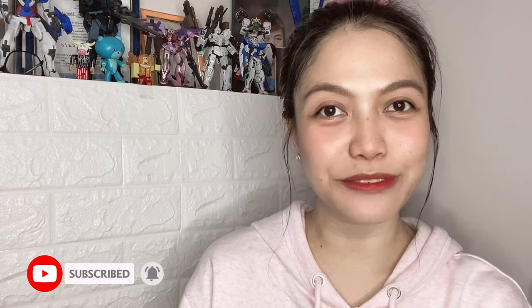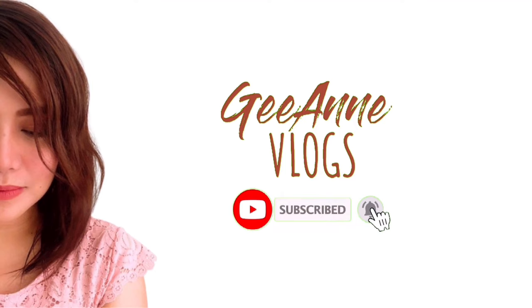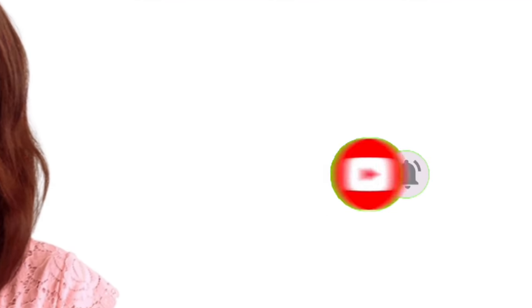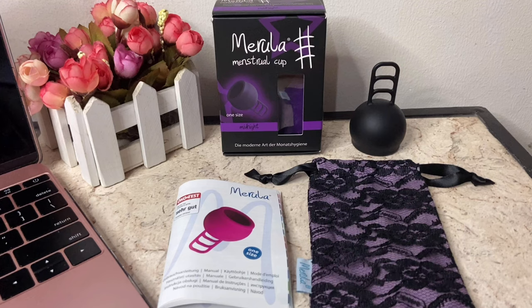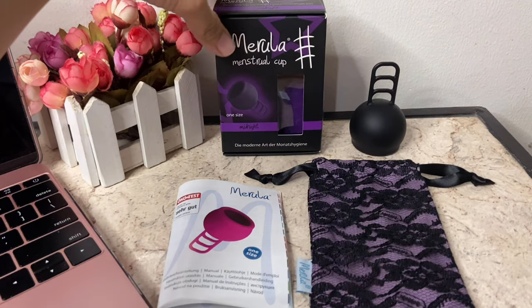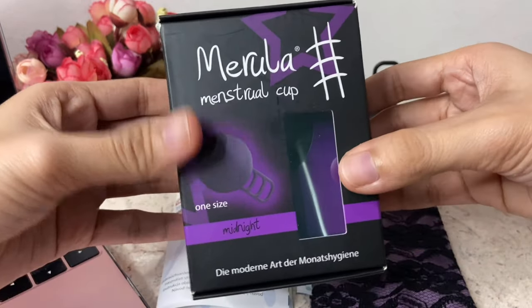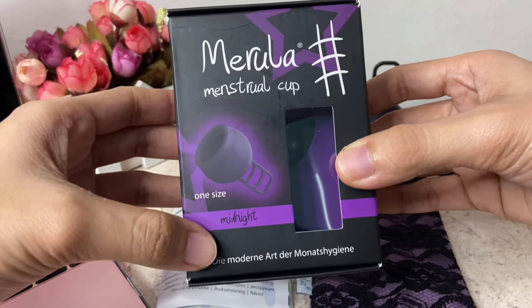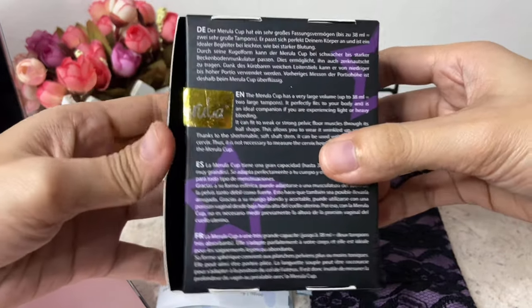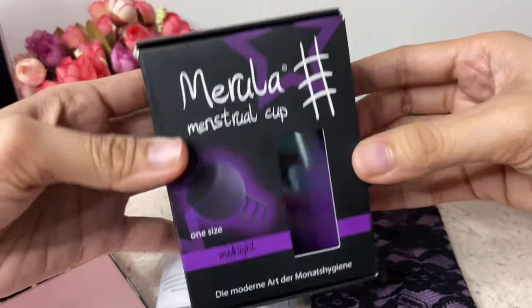Today's vlog is another Mansour Cup product review and I'll be reviewing the Marula OS. This is the Marula one size, also known as Marula OS. The box of the Marula OS contains the cup, the pouch, and the user instruction. The Marula OS box is almost the same as the Marula XL — it has the brand name, the color of the cup, a brief description of the product, a protective seal, and a barcode.